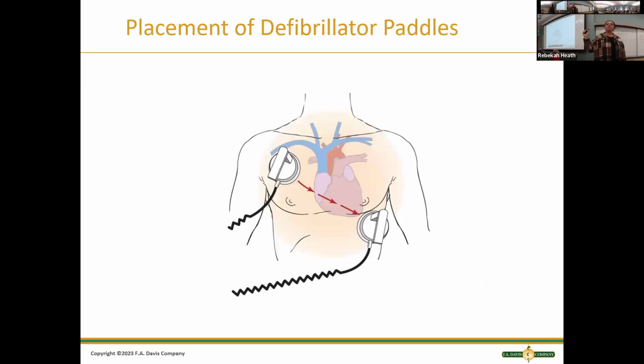It is true when you put on pacemaker patches, you usually want to go up and down. With kids, it's a little bit different because they're smaller. If you have to defibrillate kids, and you might have to someday, depending where you work, you usually go through front of chest and back of chest. Because what you want is it's sending the electrical current through the heart. So that's why we're kind of encasing the heart with a patch here and a patch here. With kids, they're so little, front and back. And we want to make sure we use specialized patches for the kids. I have specialized machines. They send lower voltage of electricity because kids are little. They don't need as much electricity or joules as we would need.